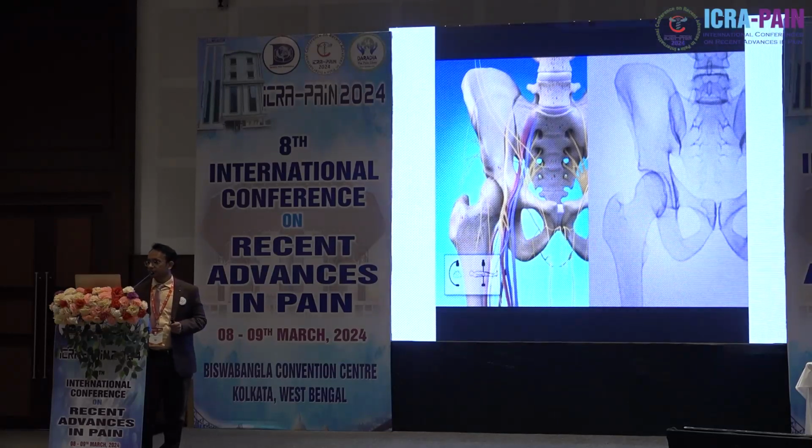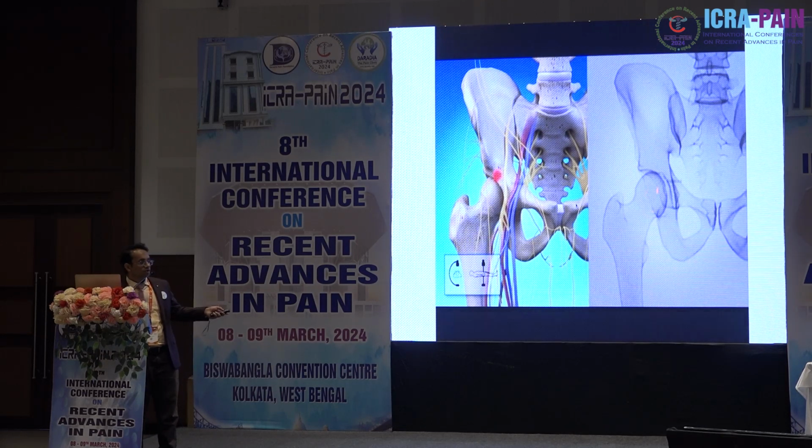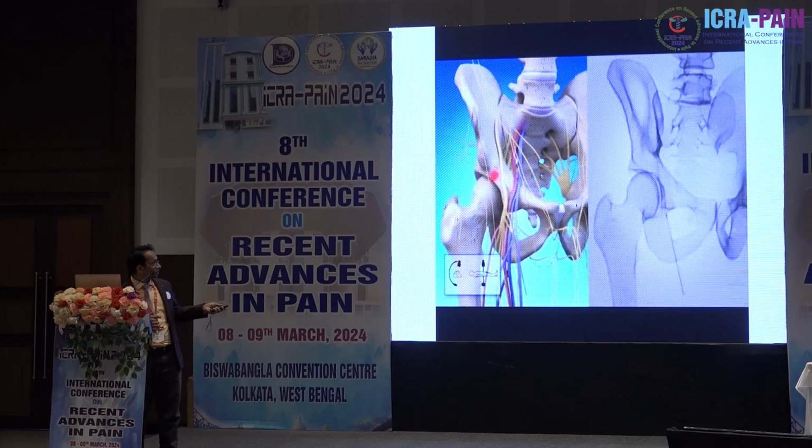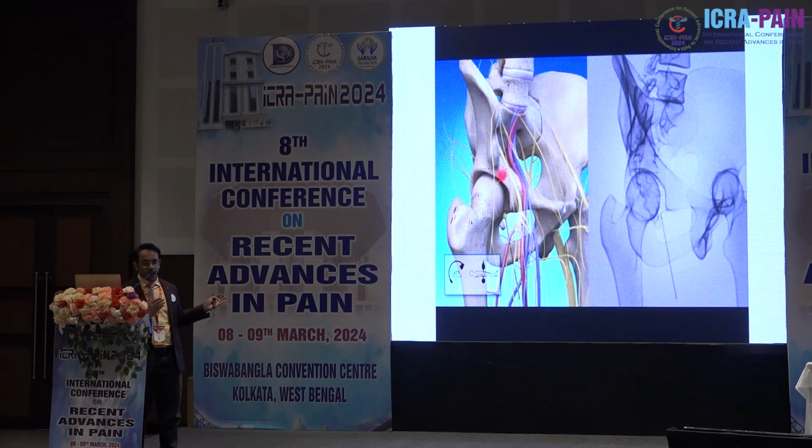Now this is a video from Avanos, of course, and here we will be seeing the different lesions happening. You can focus over here, needle going in over there and then the lesion happening. And that is for the femoral. Now we are comparing this, and this is the fluoroscopic image, wherein you can compare the lesion happening, and then for the obturator, from below you saw the needle which came up, and then you're going to see the lesion. This is the three-dimensional view, wherein you can see the lesions happening.